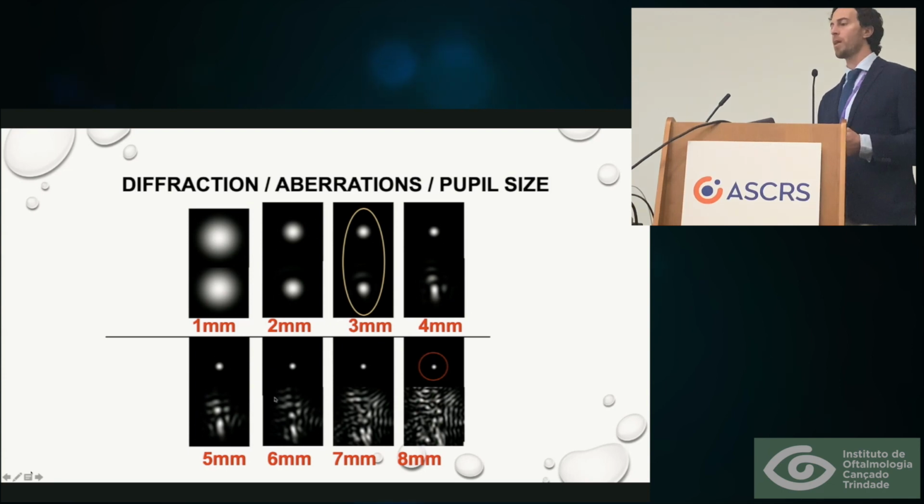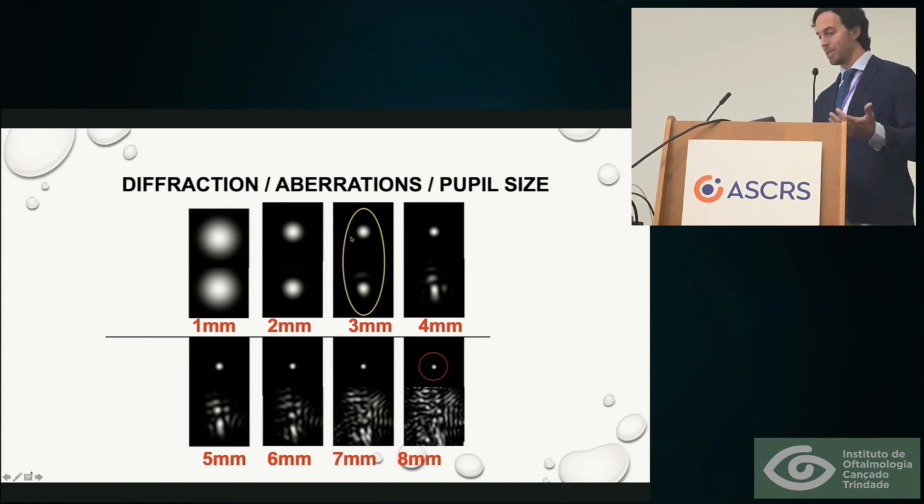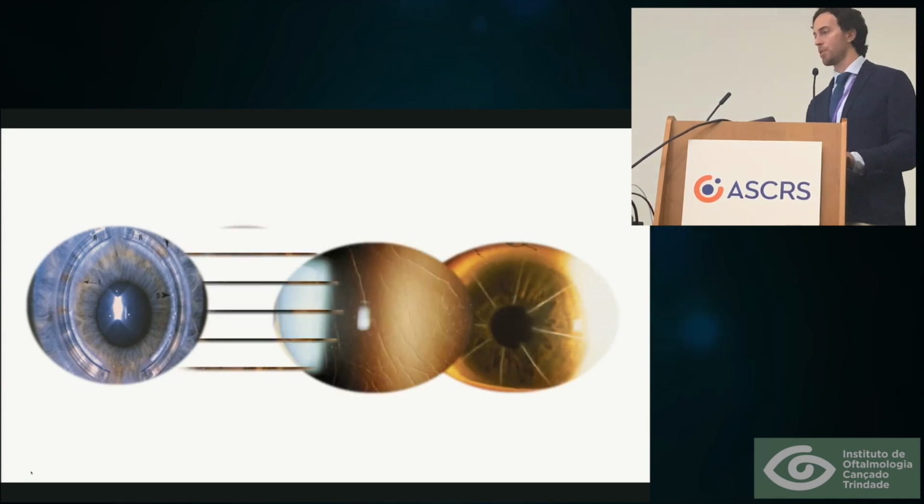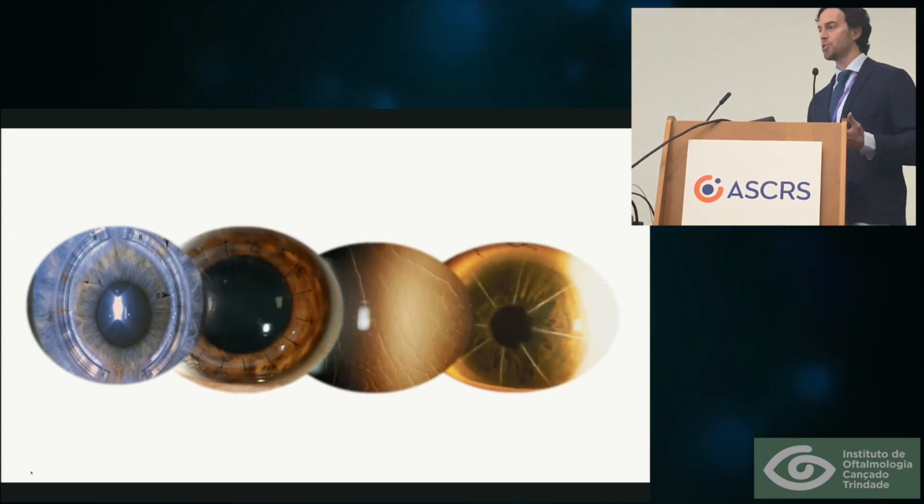So let's talk a little bit about aberrations. In a very aberrated cornea, we know that if we have a big pupil, it's a mess, it's a disaster. So here, these are the best patients because they truly improve their optical quality a lot. If patients don't have aberrations in the cornea and have a very small pupil, diffraction will be more dominant and they will be really annoyed. So the ideal is to have an aberrated cornea so that they can truly be happy after the procedure and see an advantage. It has been shown that this works great in all these types of irregular astigmatism.